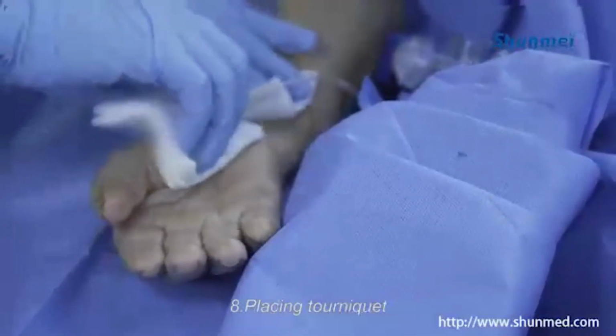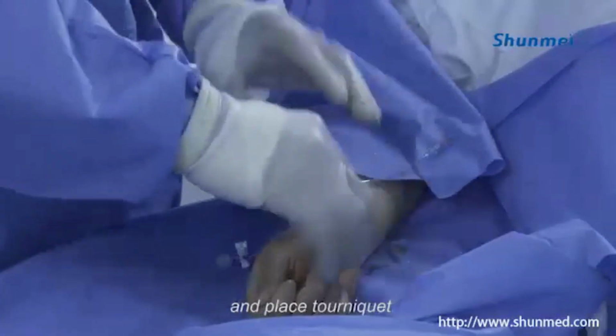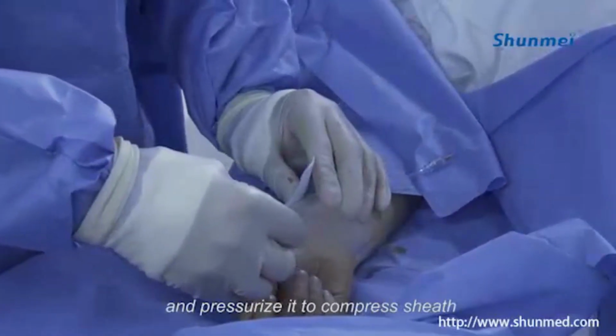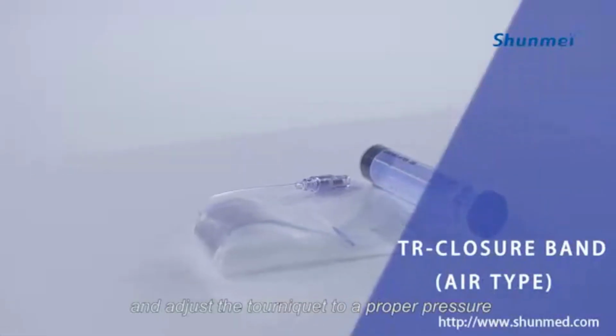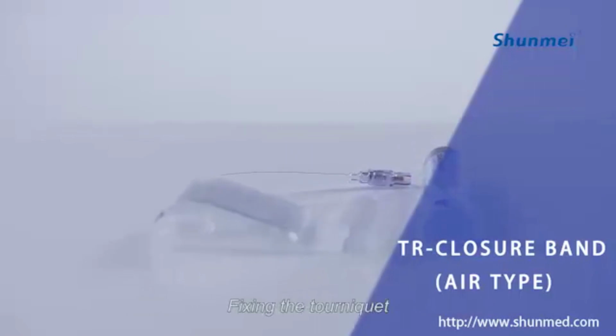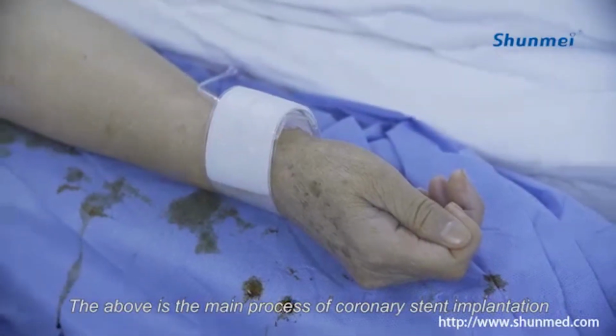Tourniquet compression. Clean the blood around the arm. Withdraw part of the sheath, place the tourniquet and pressurize it to compress the sheath, and then remove the sheath and adjust the tourniquet to a proper pressure. Fix the tourniquet. The above is the main process of coronary stent implantation.